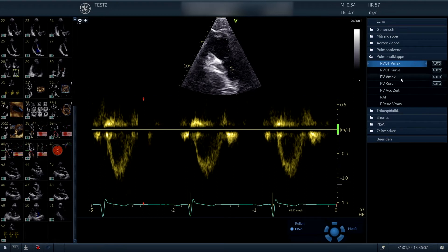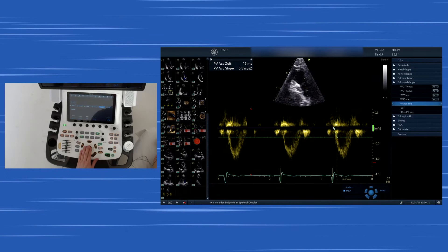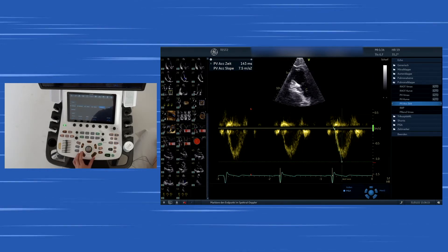If it is longer than 120 milliseconds, it's definitely normal. As you see over here, that's the measurement. It's 143 milliseconds, so entirely normal.